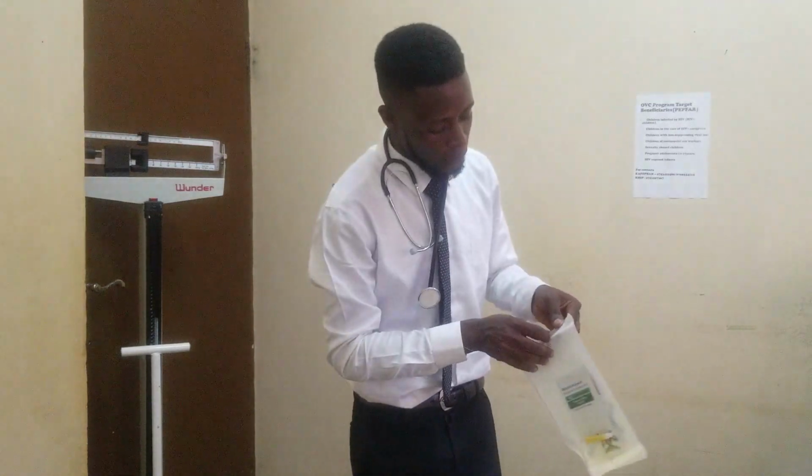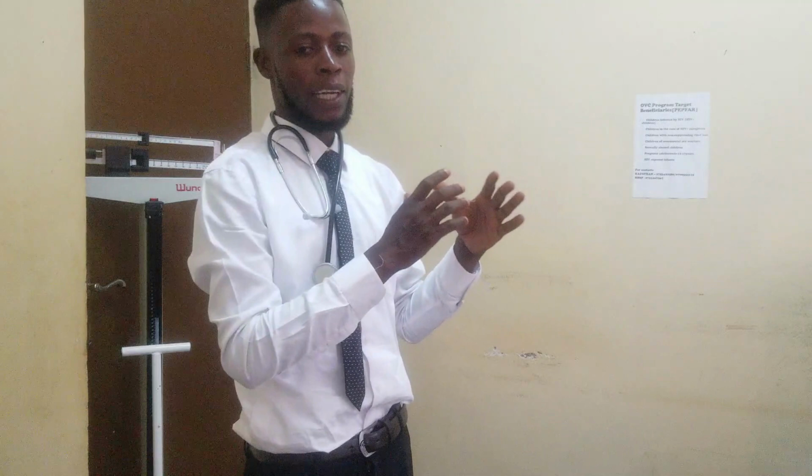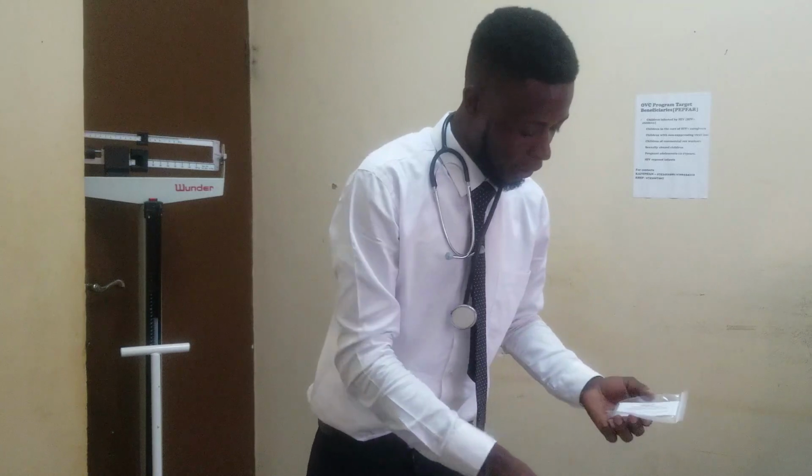So we need to create a good one. We always prefer the hand, this is done by most of the laboratory personnel, but I think every health worker is trained to take at least a blood sample very well. So use the arm of a person. If right-handed, use the left. If left-handed, use the right. On the tips, probably we prefer this or this. These are the areas. So you swab it very well. Come with the swab. So you swab that hand very well, like here.